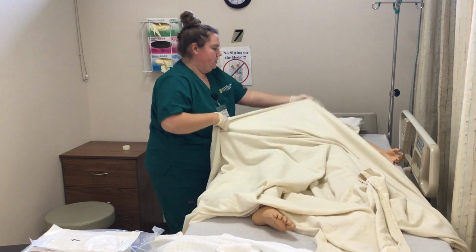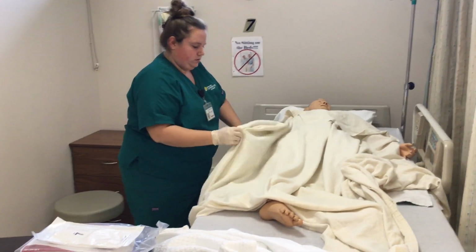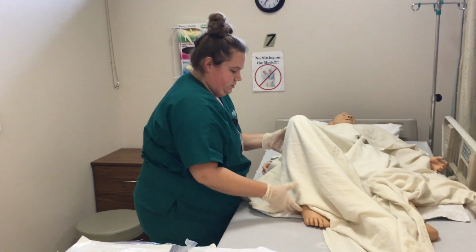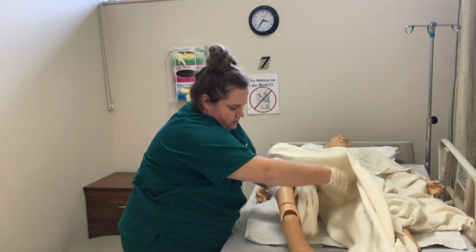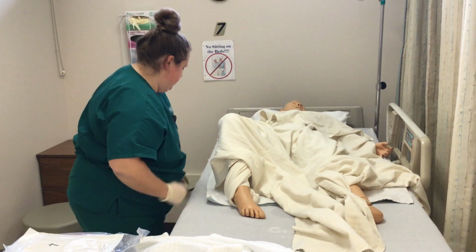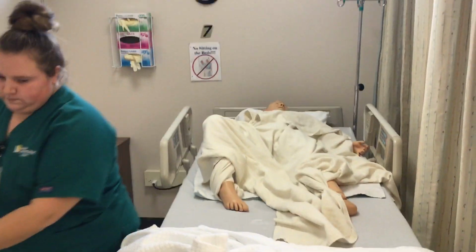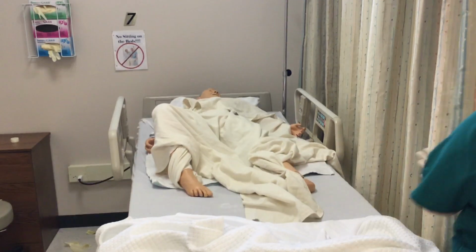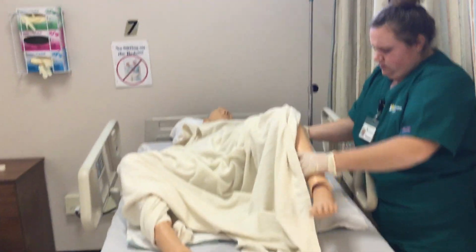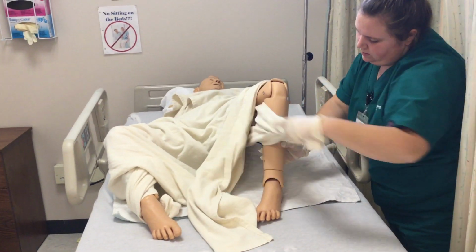And if there's no obstruction in the flow, yeah, if I do something like that or something that I broke, I wasn't even looking at you, I was just doing my own thing. If, like, when I'm opening this and I break the sterile field, you could stop it and just re-fold it. So let me know.